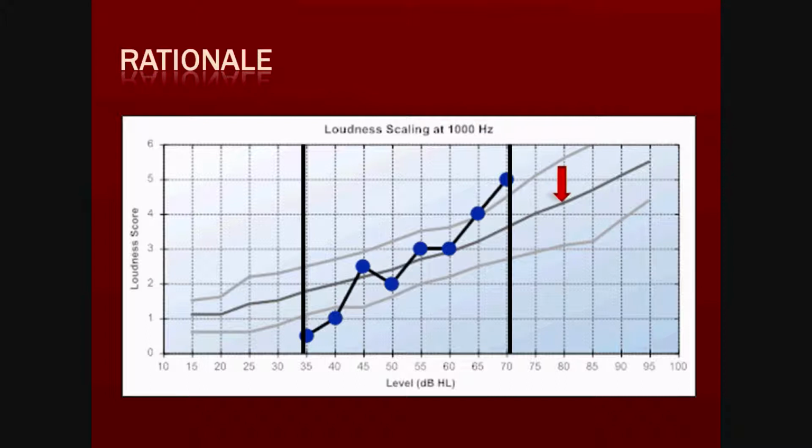The graph also contains the median values in hearing listeners, as well as the 95% confidence interval between percentile 2.5 and percentile 97.5. This represents the normal zone.